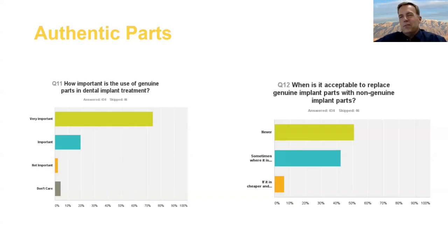Straumann's, I think, is especially fun. So Straumann owns Medentika and Neodent. Medentika is the OEM part for Neodent implants, but it's considered third party for Straumann, who owns them. So I guess what I would say about this is just know what you're getting yourself into. Make sure you have a good conversation with your laboratory about, these are the kind of parts I want to use. What do you see? And make sure that you have clear communication about that, so you're getting what you want.